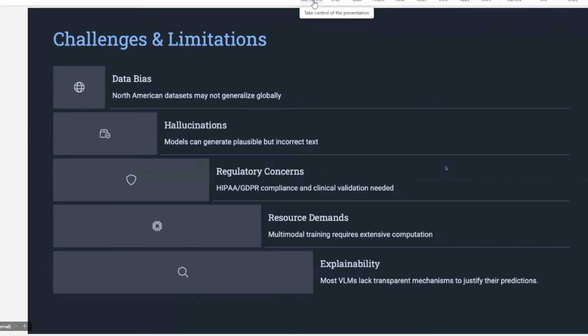If you pass it an input radiology image, a chest X-ray, or a CT scan, it is not quite clear what makes them predict a particular token, or what makes them classify the image as a particular class. So explainability is another portion which needs to be explored.